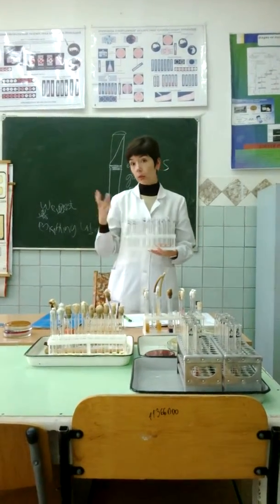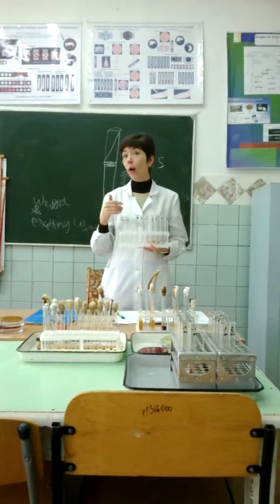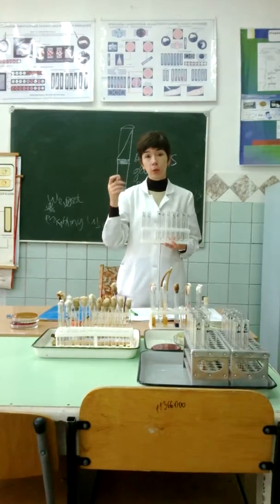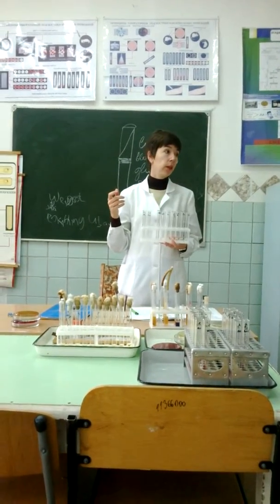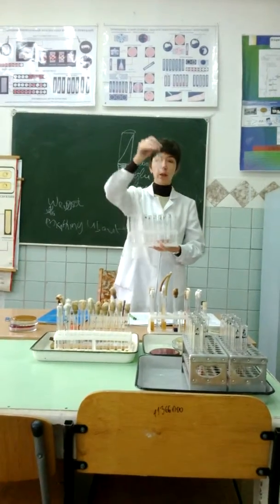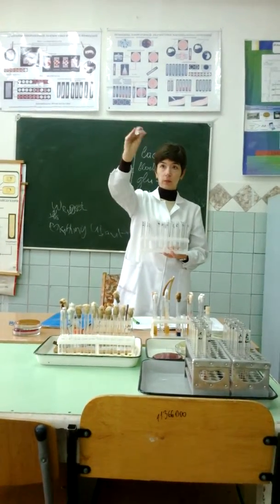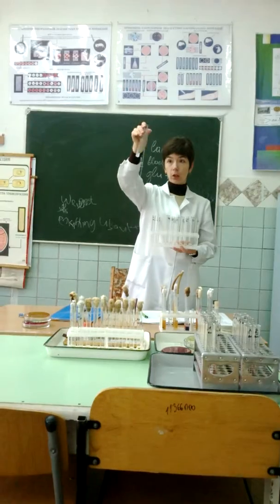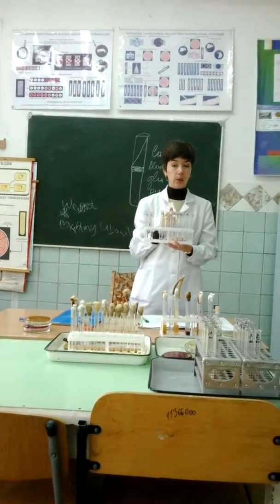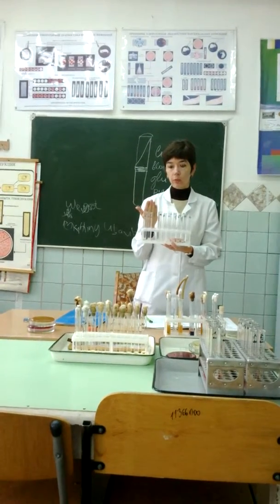How do we read results? As formation or no formation of agglutination. If antibody is present in patient serum, this antibody agglutinates the diagnosticum of killed Salmonella, and we obtain sedimentation and clumping. It means a positive result, and we may count the amount of antibody.